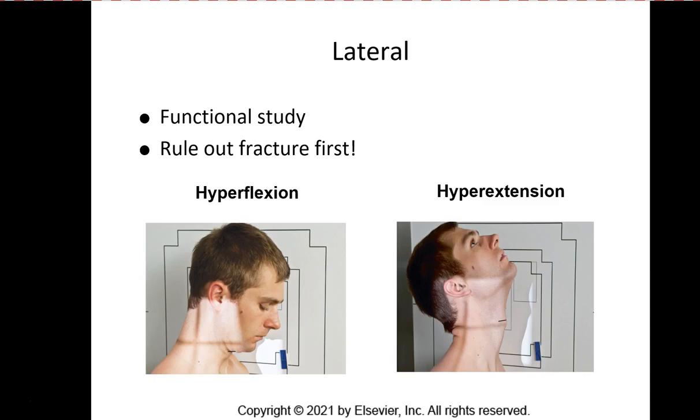The patient should be positioned in a true lateral. We typically do left laterals again. The shoulders should be nice and relaxed. If they can, you can have them hold sandbags if they don't have weight restrictions. You're going to use 72 inches SID, again, because of the OID. You want to center again at C4, just like a typical lateral. And you would do this on expiration, encouraging the patients to relax their shoulders.